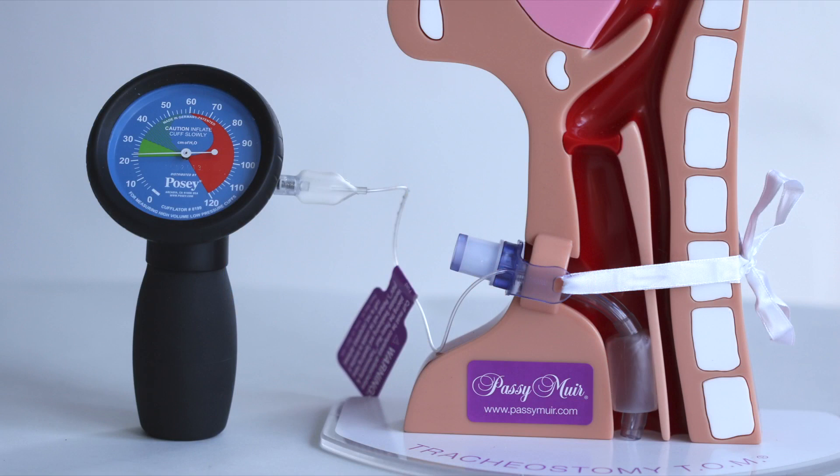A cuff manometer is designed to measure cuff pressure. It can also be used to inflate the cuff or remove air from the cuff of the tracheostomy tube. The gauge shows the pressure in centimeters of water. There is an inflator bulb and air vent button that can be used to adjust the pressure by adding or releasing air.